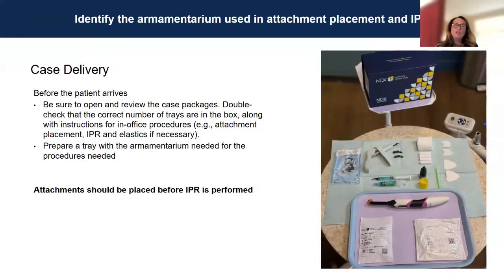So now we're going to do case delivery, and the doctor is using our NDX aligners, but like I said, you have Candid, you have Invisalign, ClearCorrect, SureSmile, and all the other ones that are out there now too. Before, as an assistant, when I would get the box, I would open it up and make sure there's the correct number of trays in the box that are on the treatment plan.